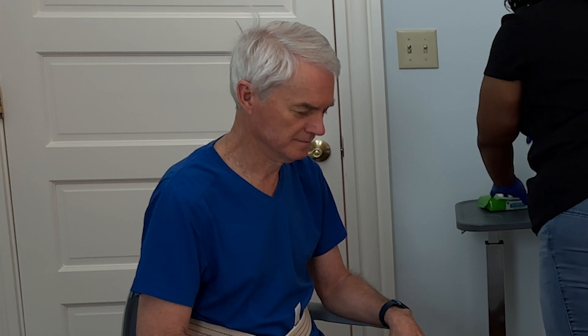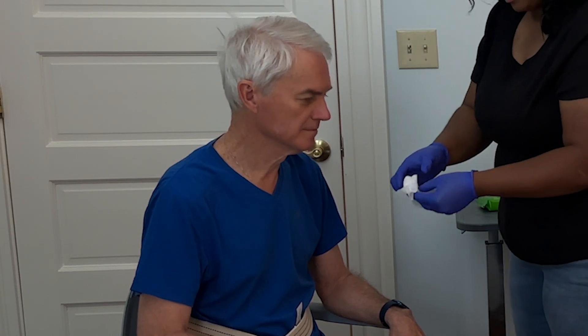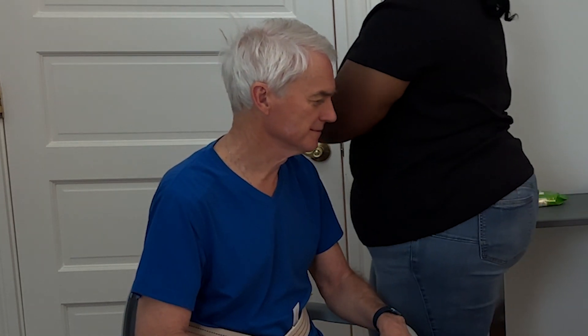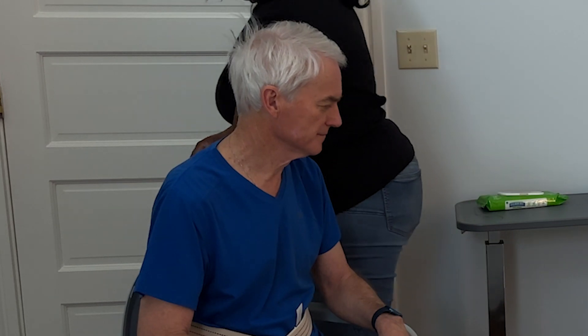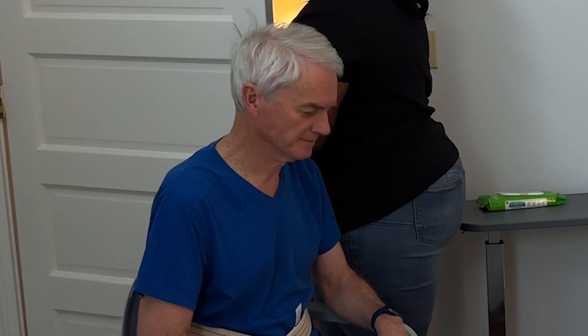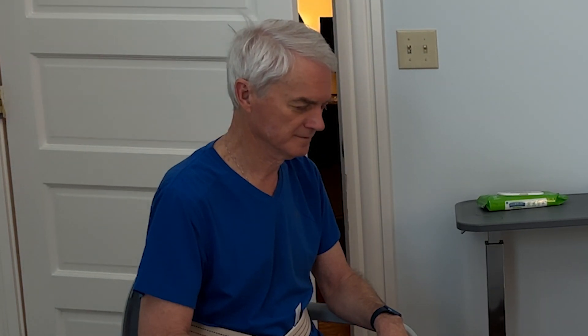Before your loved one sits down, they can remove their pants. If your loved one is unsteady, you can assist with removing their pants and undergarments. Ensure that they have been lowered enough so your loved one does not sit on their clothing when they sit down on the bedside commode. Ensure your loved one is comfortable and properly positioned. Once your loved one is seated, ensure they are comfortable and balanced on the bedside commode.